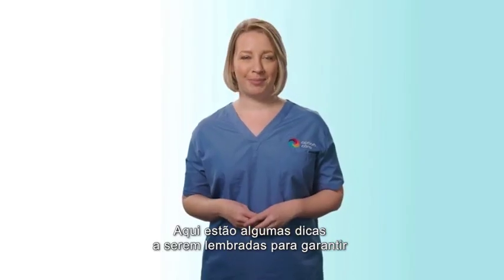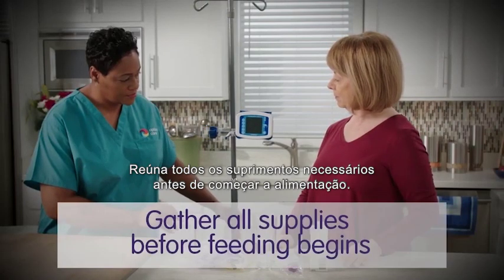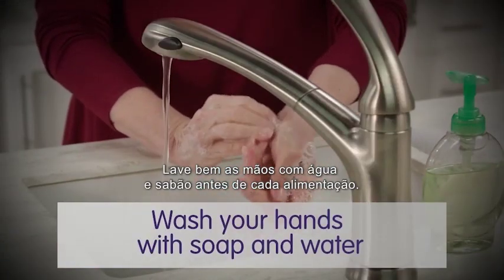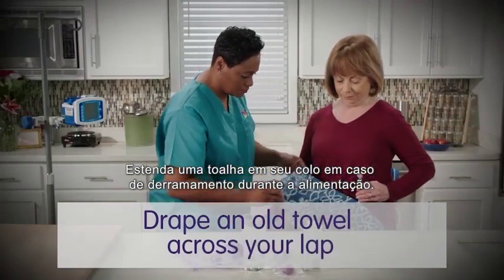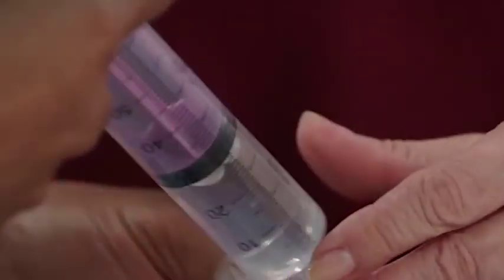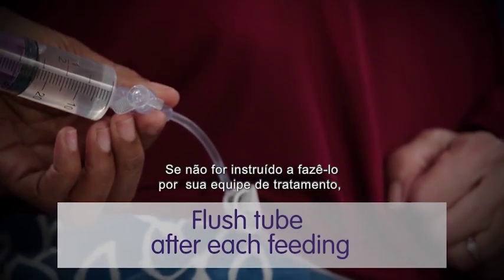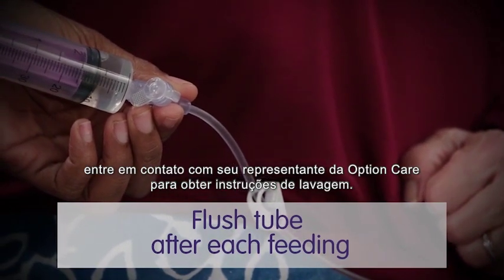Here are a few tips to remember to ensure you are administering your tube feeding effectively. Gather all supplies necessary before you begin your feeding. Wash your hands thoroughly with soap and water before each feeding. Drape an old towel across your lap in case of spillage. Sit in an upright position or elevate your head by at least 30 degrees during feeding administration. Make sure to properly flush your tube at a minimum after each feeding. If not directed to do so by your treatment team, please contact your Option Care representative for flushing instructions.